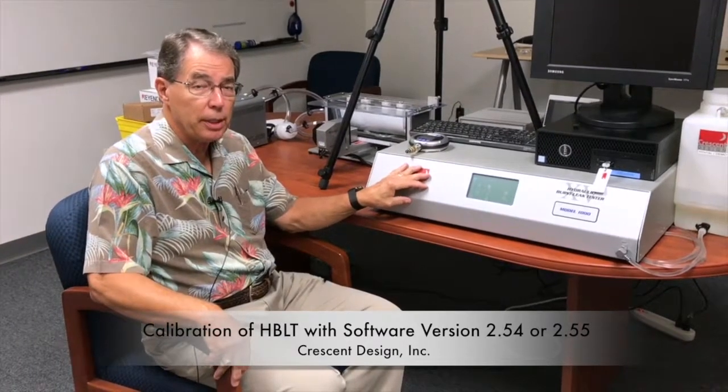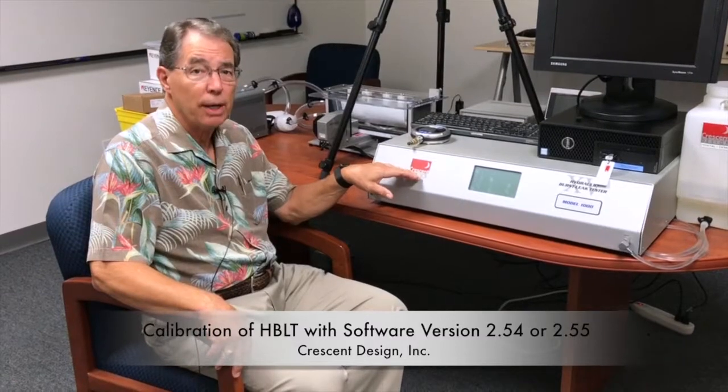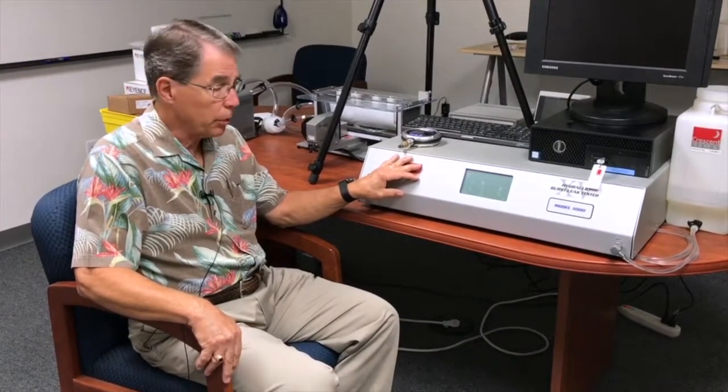Hello, we're here today to demonstrate how to calibrate your HBLT that is running software version 2.54 or 2.55. Version 2.55 is the most current version and its calibration procedure is somewhat different than previous models, so this will help you understand how to do that. The procedure is also documented in the manual, which is available online on our website if you wish.